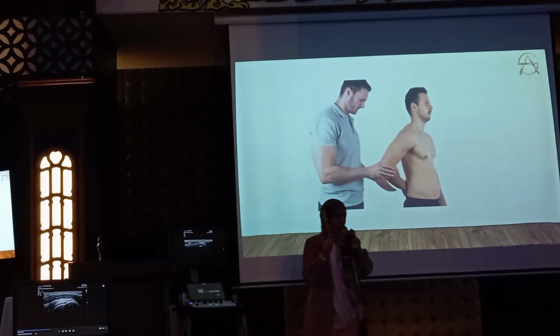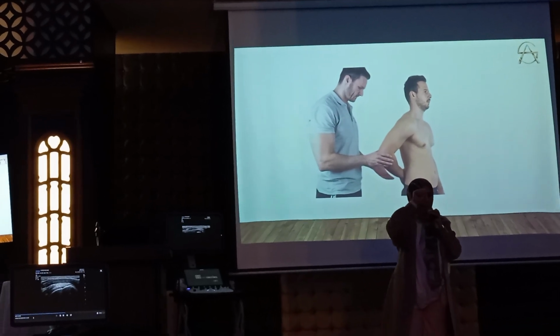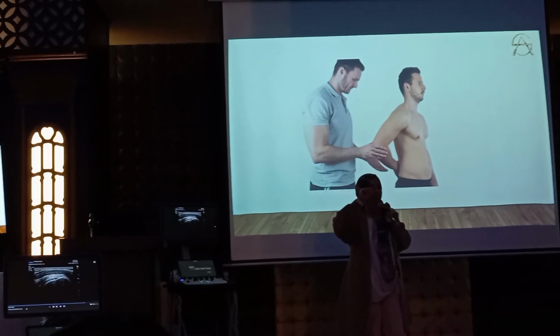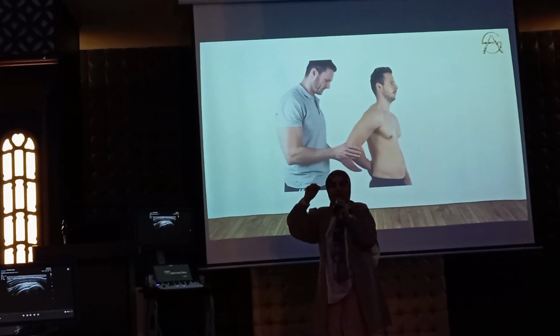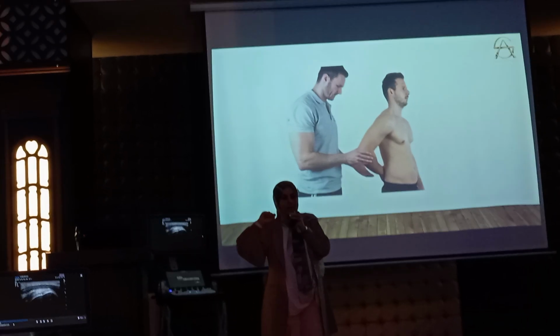We begin the exam. Palpate the scapula, the spine of the scapula, and put the probe transversely above the spine of the scapula, and begin from medial to lateral. At the medial part, it has a fish-like appearance with a small thickness. Continue lateral, lateral, lateral until its thickness increases.